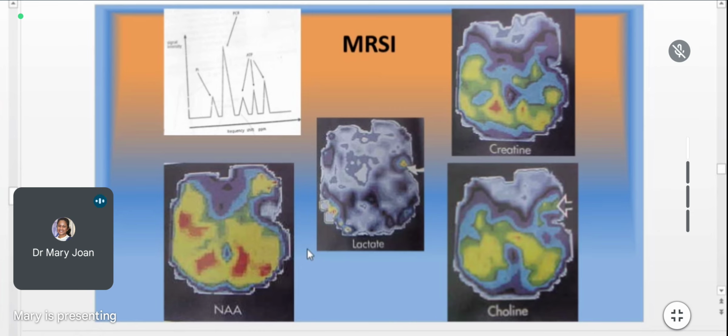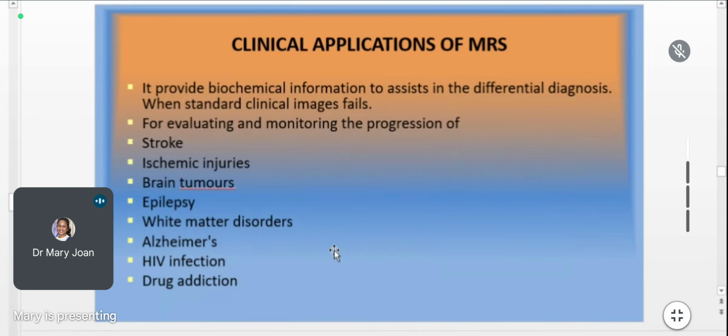And with the help of additional contrast agents or manipulation of the techniques, the shimming, the shim coils or gradient coils, the signal applied or the RF pulse changes, we can get further information on how that exactly is, and sometimes how it acts from time to time, whether there is blood flow to that or whether there is no blood flow. All this information we can get from this imaging.